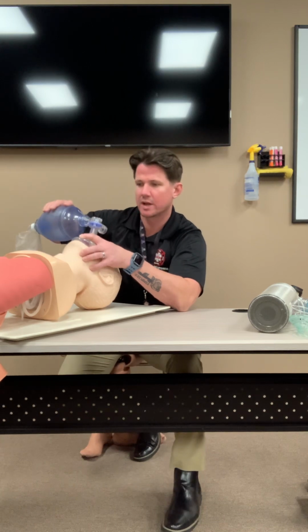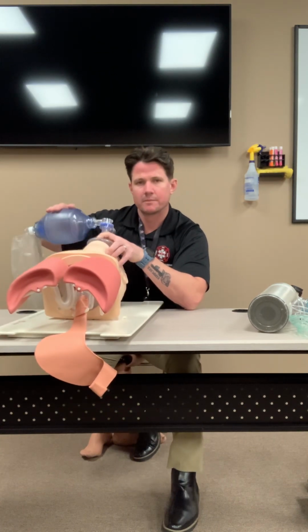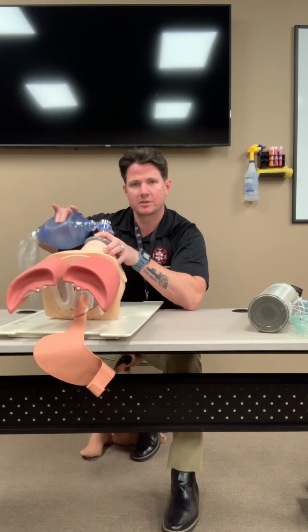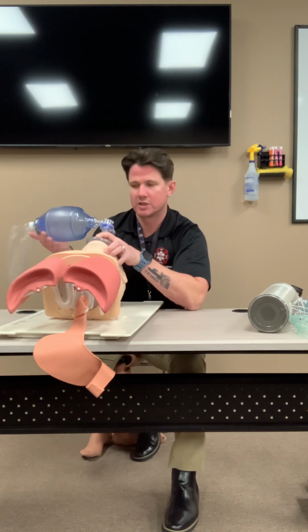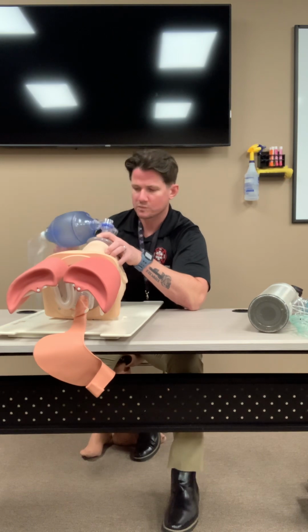Another thing, if you notice when I squeezed, right, just enough to get chest rise, all right? Let's see if you can see here. You can see a little bit that long. I barely even squeeze this bag, maybe halfway, right? There's a lot of oxygen in this device. We don't need it all, okay? So just enough to get that nice chest rise. I know I've administered a good breath, right?